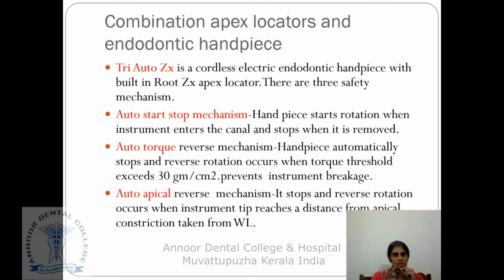So you have three inbuilt mechanisms in the same machine: one is auto start stop, auto torque, and auto apical reverse mechanism.